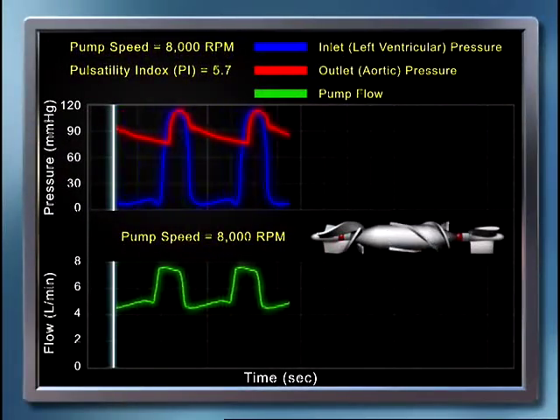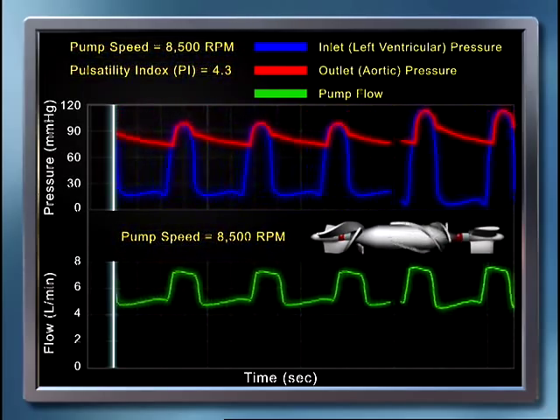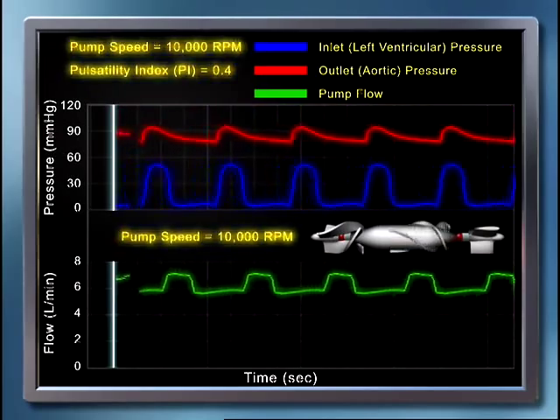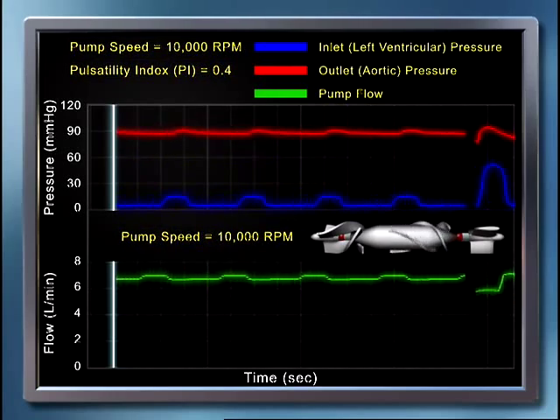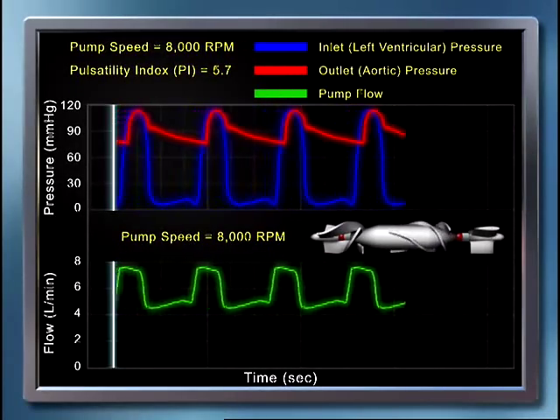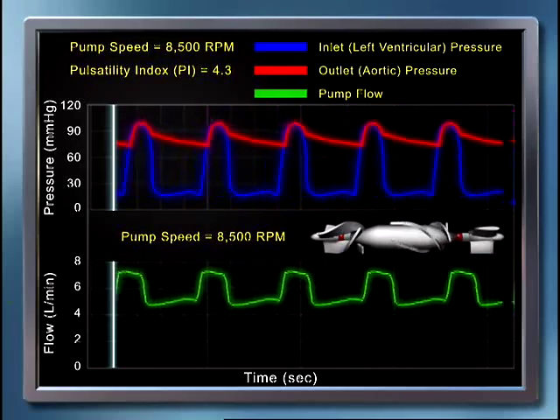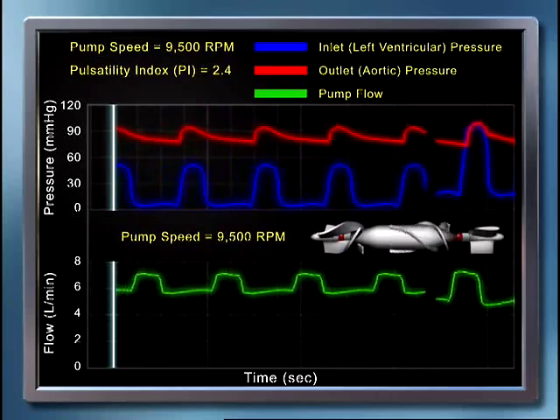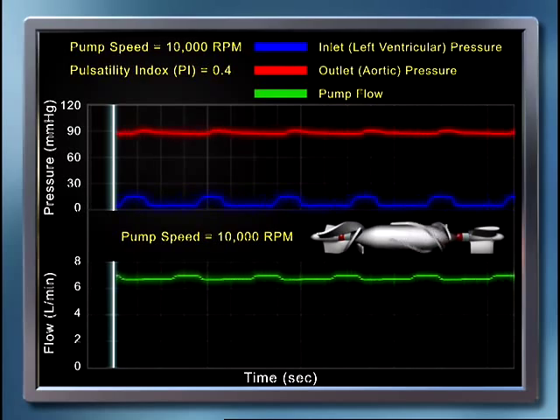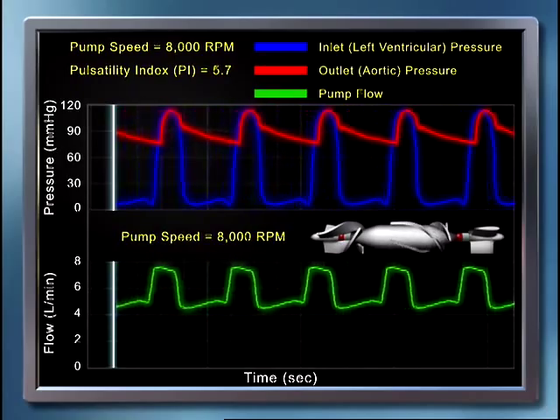For a given differential pressure, as the speed of the pump is increased, the flow through the pump increases and leads to greater ventricular unloading. As the pump performs more ventricular unloading, the left ventricle builds up less systolic pressure, causing the blood flow pulsatility to decrease. This will be seen in the flatter pressure and flow curves as the pump speed is increased from 8,000 RPM to 10,000 RPM, with a corresponding decrease in the pulsatility index. As pump speed continues to increase and the left ventricle is further unloaded, the aortic valve opens less frequently.